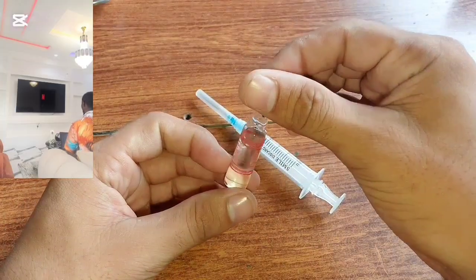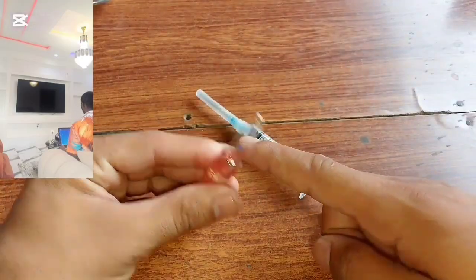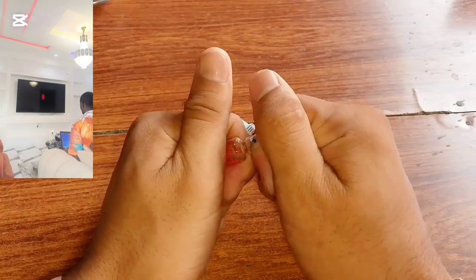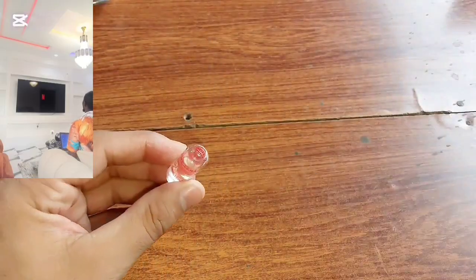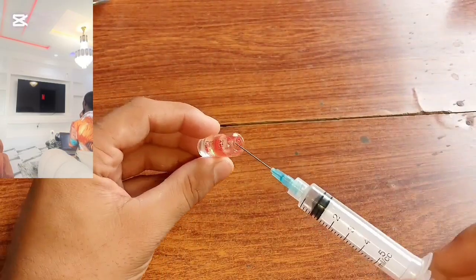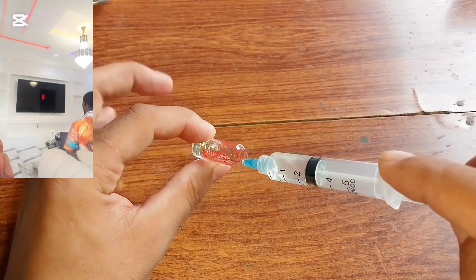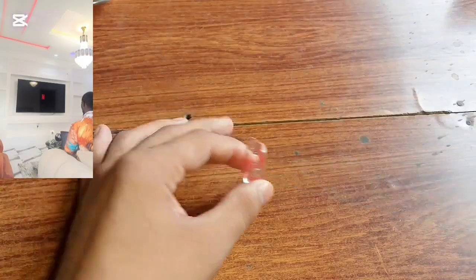You check and make sure you open from these dotted spots. Some ampoule bottles are very hard to open, so you may want to break it with a gauze or forceps.